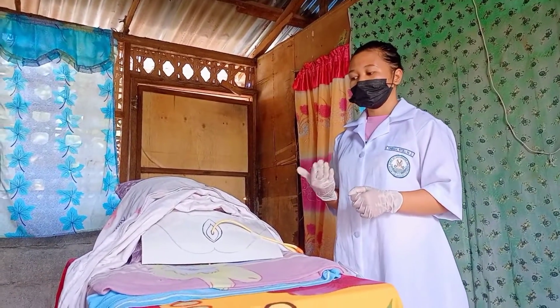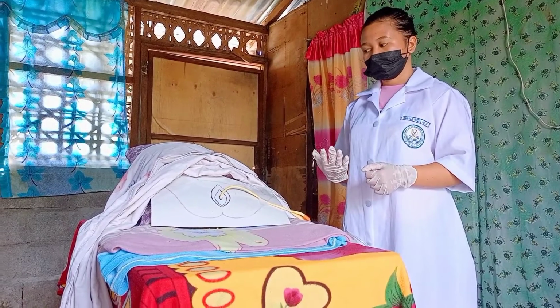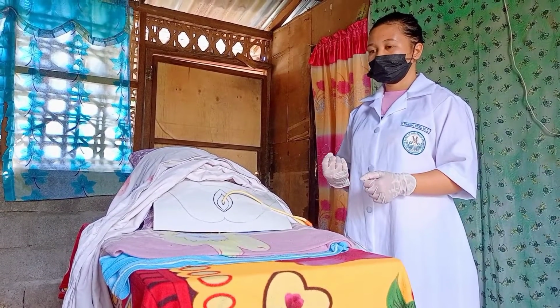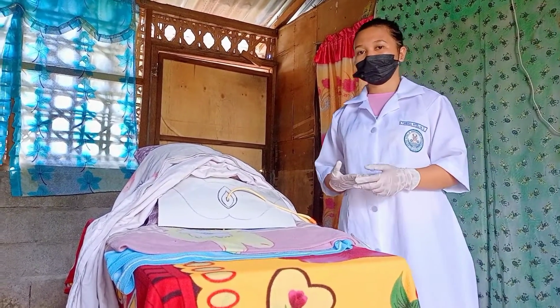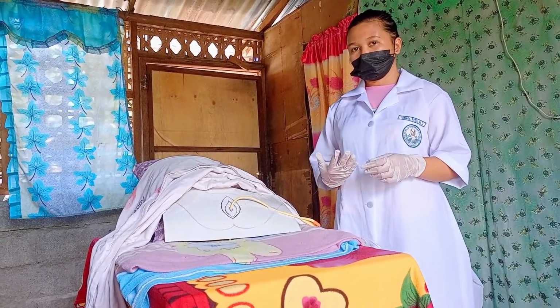And also change linen as needed, including soiled linen or linen that became damp during the catheterization, to ensure the patient's safety, comfort, and privacy.